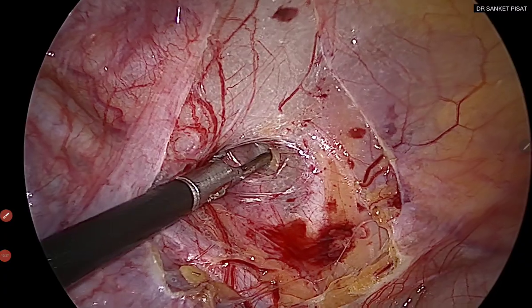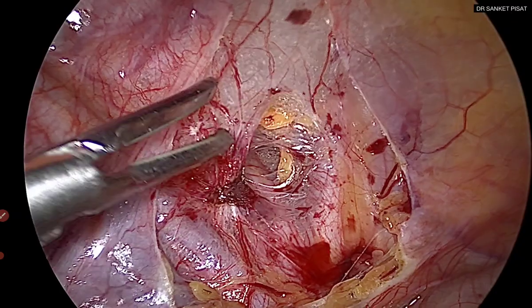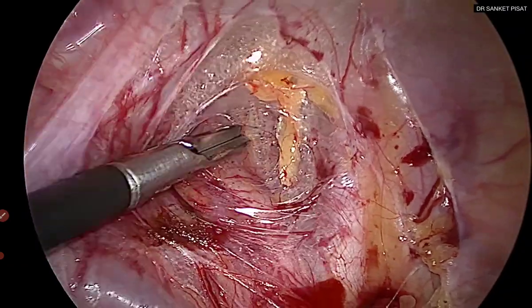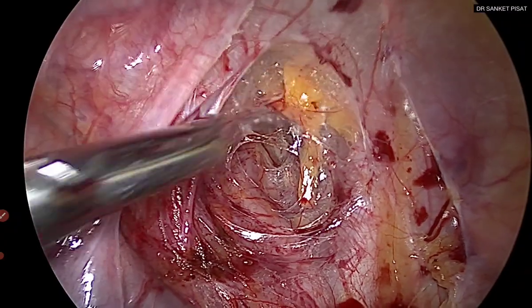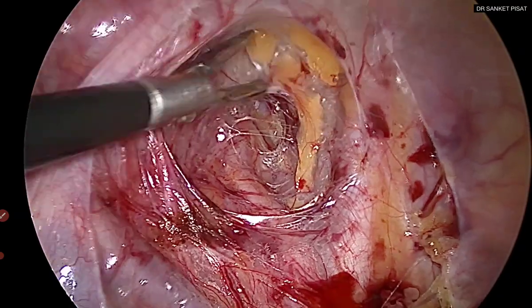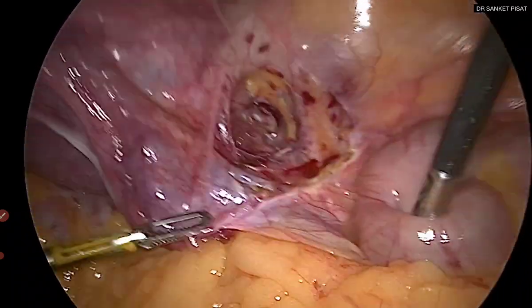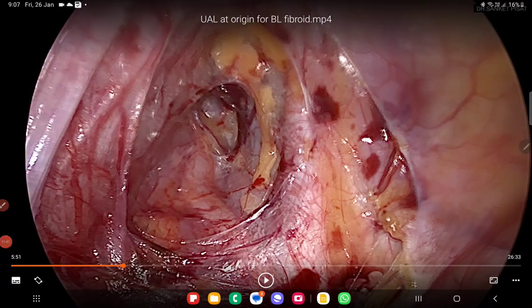As we proceed, I am simply dissecting the loose areolar tissue away. Any small or stray bleeding that comes up has to be tackled at this stage, because a soiled field makes it really difficult to find vital organs. Notice that I am not trying to find any structure — I am just cutting and dissecting the loose areolar tissue away. Some vascular structures and arteries are being seen underneath but I am not going to identify or do anything with these vessels at present. Short bursts of energy are best as they do not damage anything.